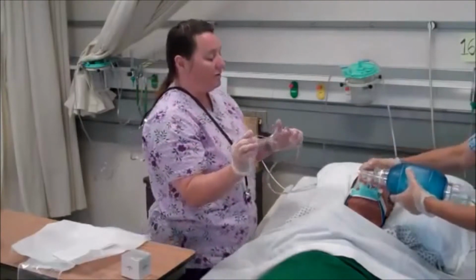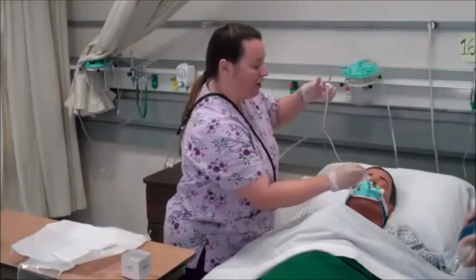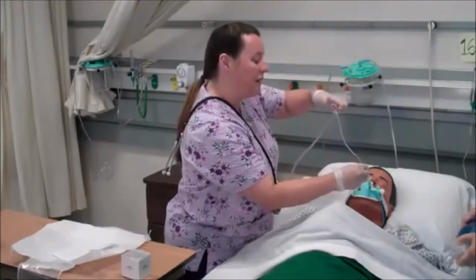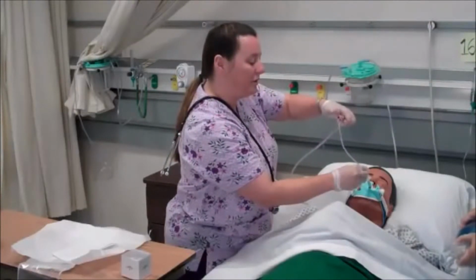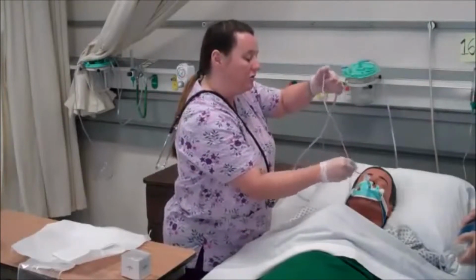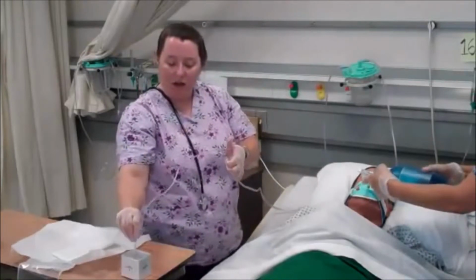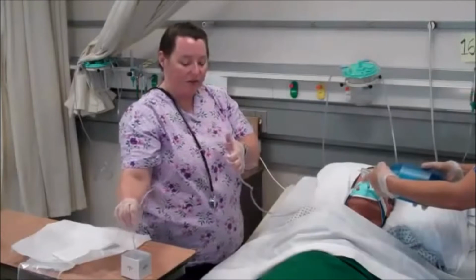And as I go down, I'm going to maintain sterile technique. I'm going to go straight down the ET tube without touching my hand to the tube until I hit resistance or the patient starts to cough. Patient starts to cough, hit resistance, I will pull up 1 centimeter to 2, and I will apply intermittent suction as I come up the tube so I don't hit their internal mucosa. Sterile technique still. I'm going to clear my tubing, and I'm going to reassess my patient.